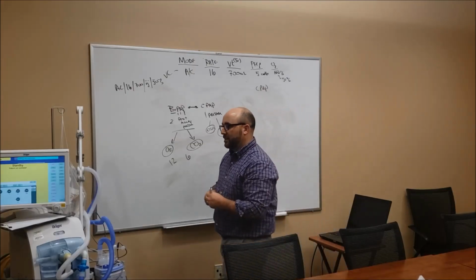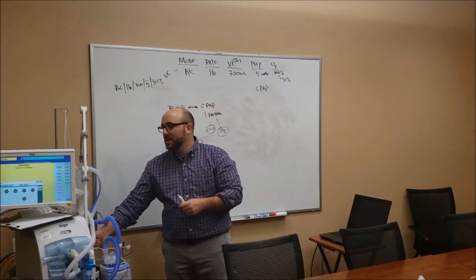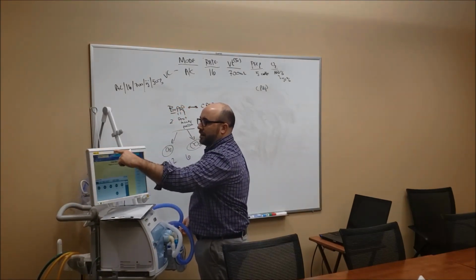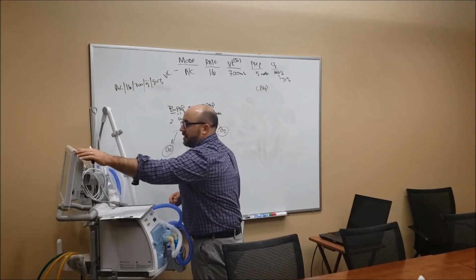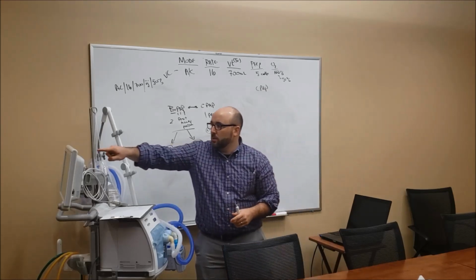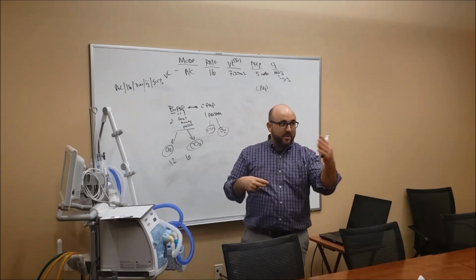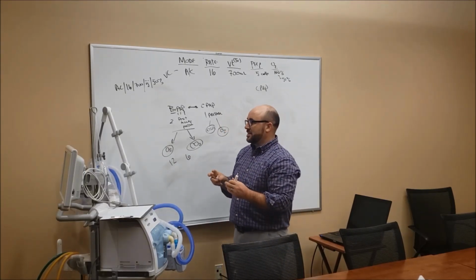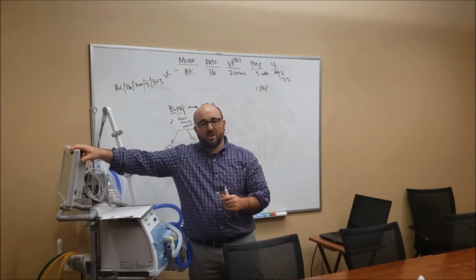Know those alarms. There are some little piddly alarms that'll come up. We call them yellow alarms, but then there are red alarms. And how you're going to know that with this Draeger is on this bar right here. The cool thing about it is that it's 360 degrees. So if this is facing the patient and you can't see it at all, this will come up red on this line right here. It's really good for ICUs when you have a lot of ventilators and you hear one going off and you're like, which room is that? All the nurses have like a 6th sense up there, so they know exactly which room it is. But if you walk by and you see red on this, that's a red alarm, and needs something done about it right now.